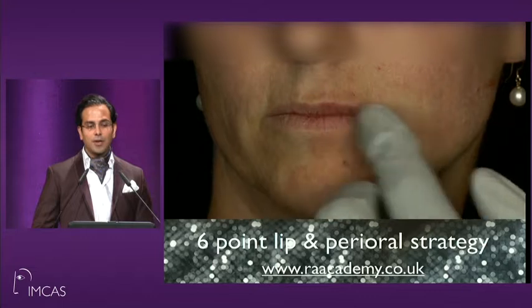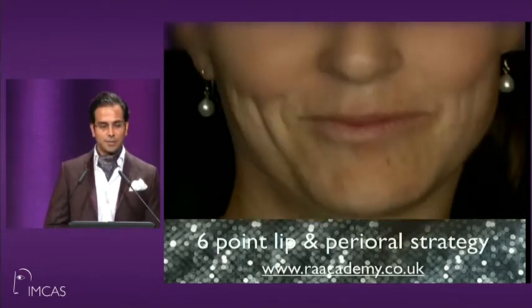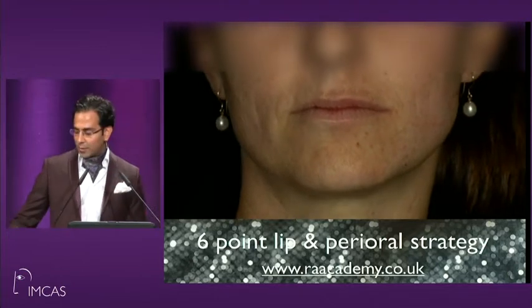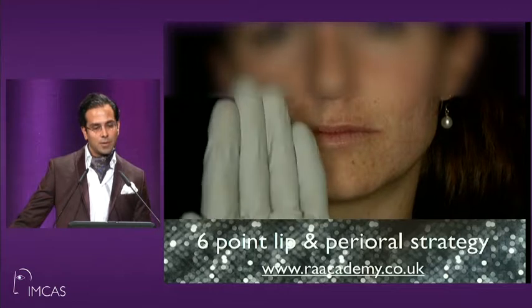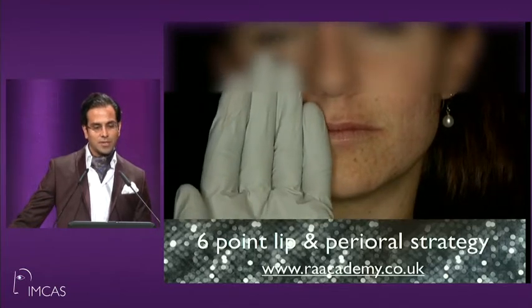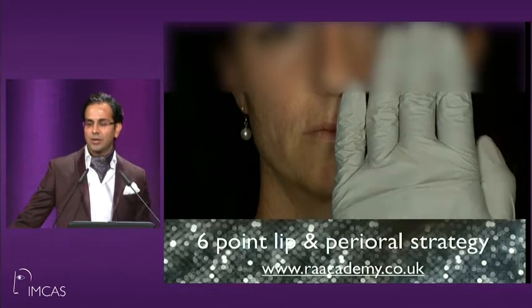And you can see now that her volumetry is much more balanced and that she has a very nice result there. And I think she'll do one final kiss now just to show the resolution of the dynamic problem. You can see on the treated side eversion, and look at the depression and the collapse of the tissue on the untreated side.